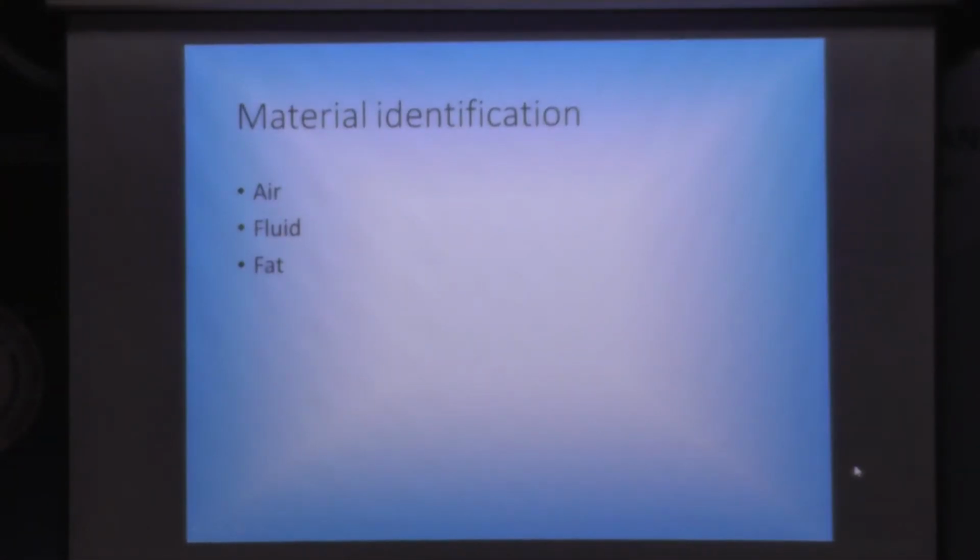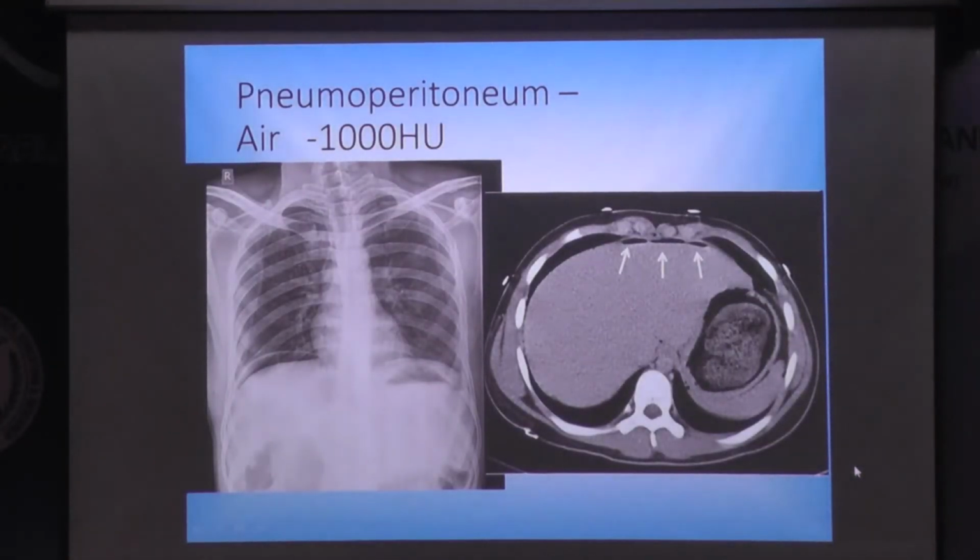Now, what can CT or radiology do apart from just structural assessment? It can also give you an idea of what material you're dealing with, especially identify air, fluid and fat. How does it do it?